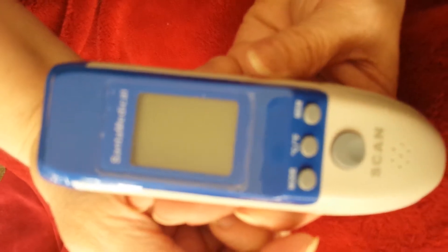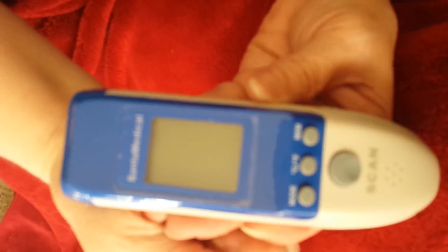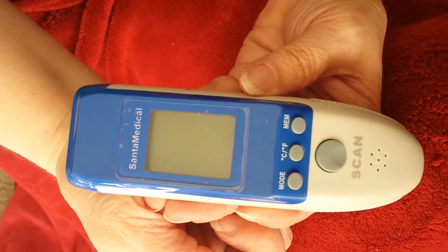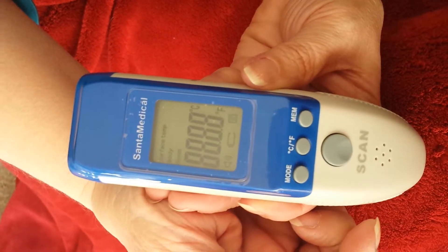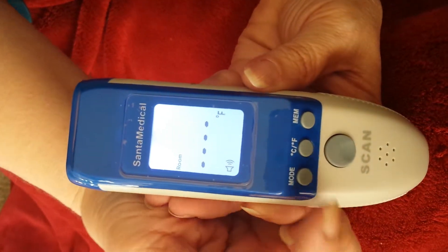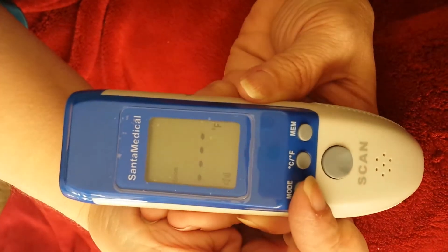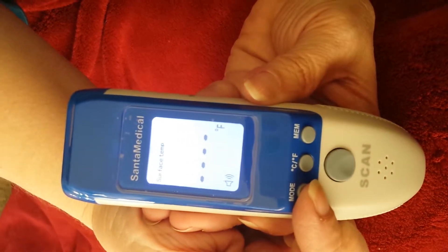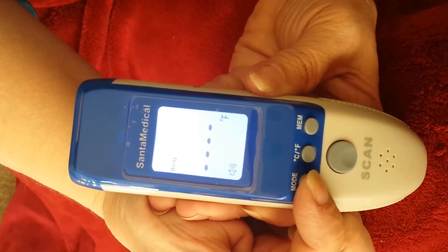Today at Dragonfly Tales we are reviewing a non-contact infrared thermometer by Santa Medical. It has a mode button that gives you a choice of surface temperature, body temperature, or room temperature.